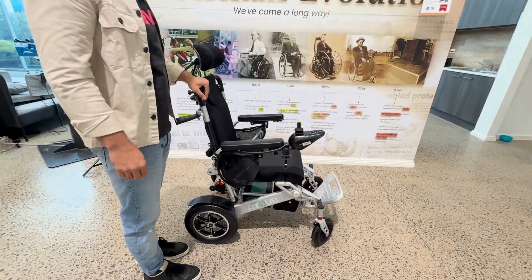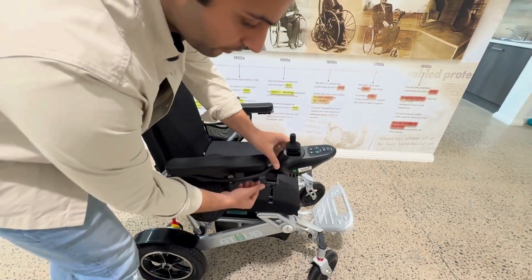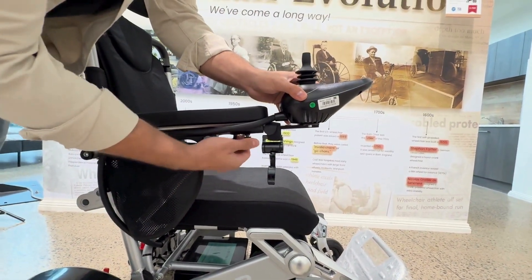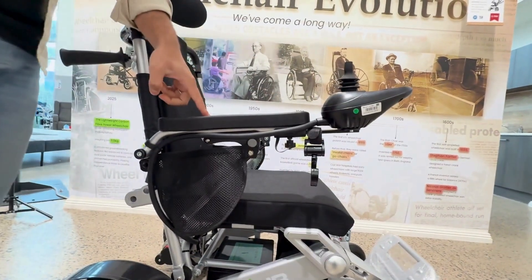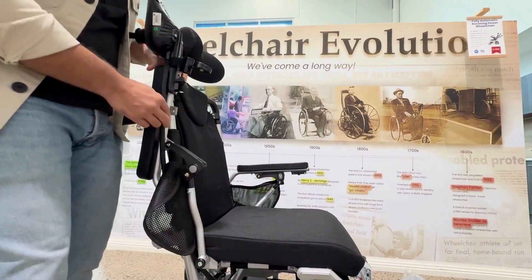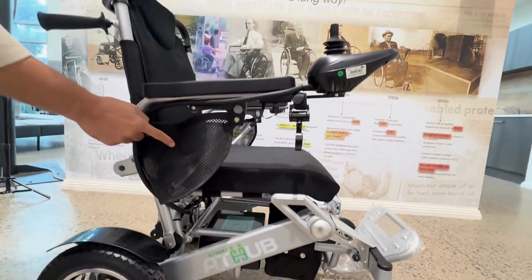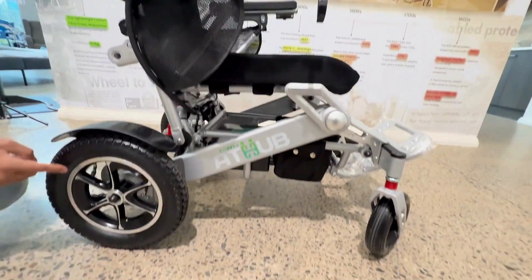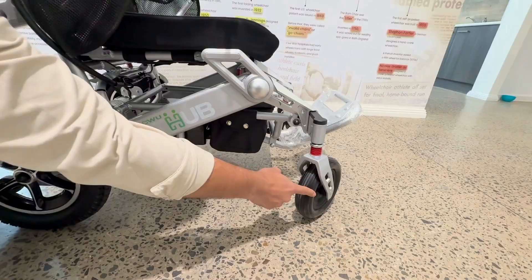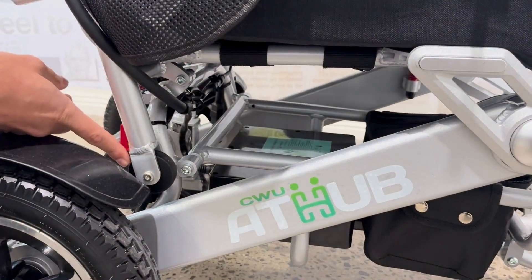Coming to the side profile of this wheelchair, it comes with a 360 joystick controller and the length of this joystick controller can be adjusted using this screw. It comes with a 90-degree flip armrest — by simply pressing this grey button, you can flip the armrest up to 90 degrees for easy transfer. It comes with two side pockets. The rear wheels are 12-inch pneumatic tires and the front wheels are 8-inch solid tires. These wheels are used when the wheelchair is folded so you can move it easily.